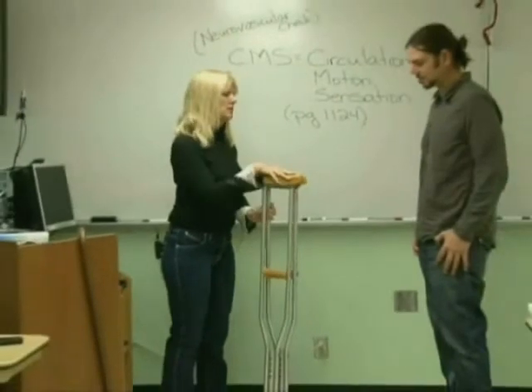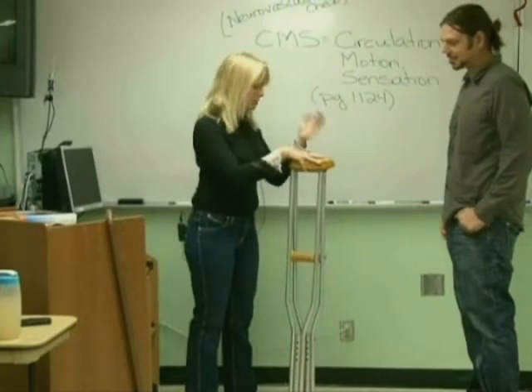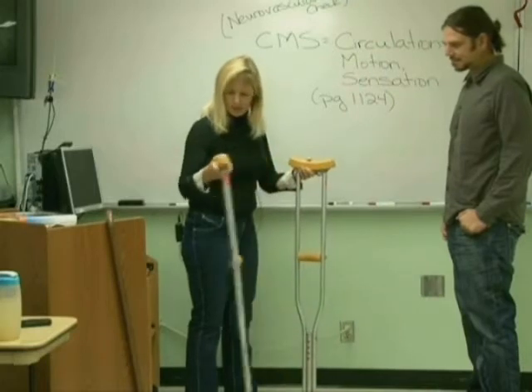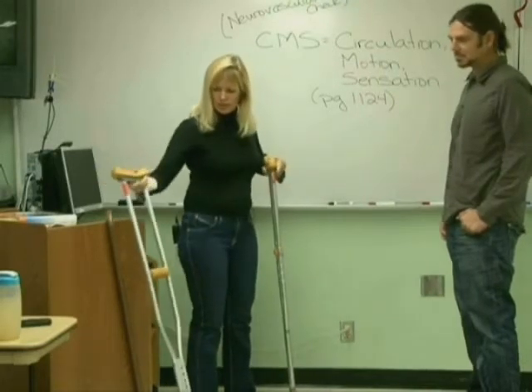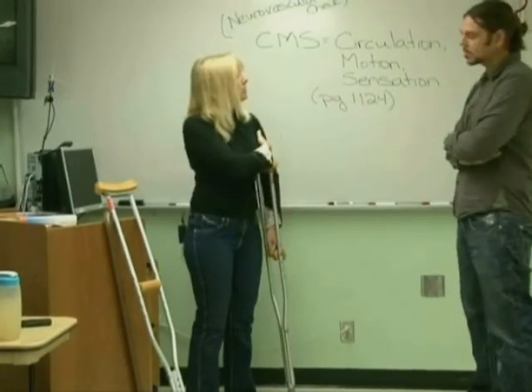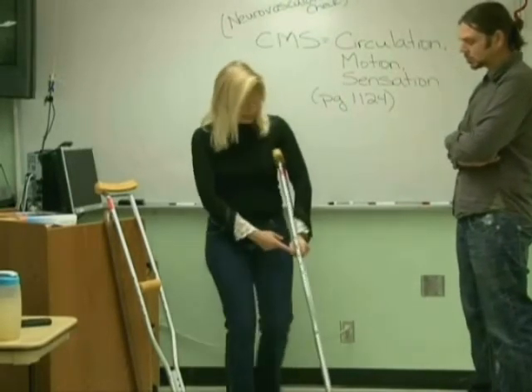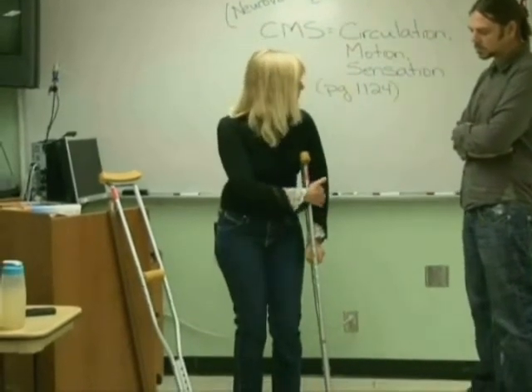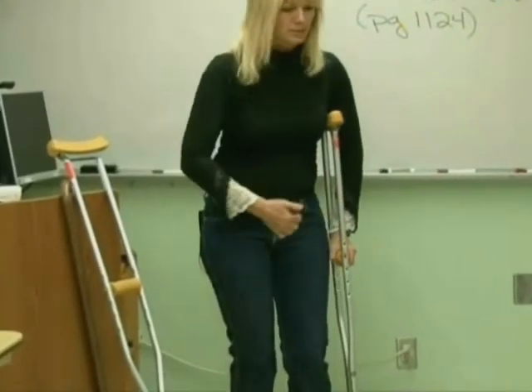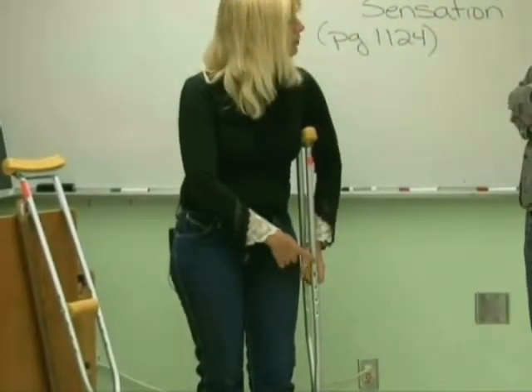Double-check them like this. Try not to let your friends play with them because you'll have to adjust and readjust them — they're not toys. Make sure they're the same height. When you put them underneath and check for height, you will be at maximum 2 to 3 finger widths below your armpit. When you adjust the hand grip, your arm should have a slight bend — about a 30-degree bend in the arm.